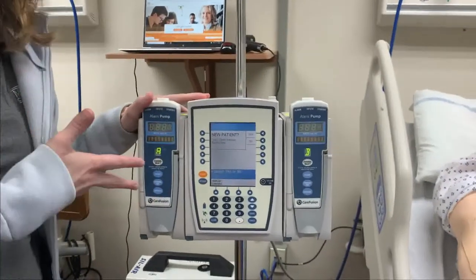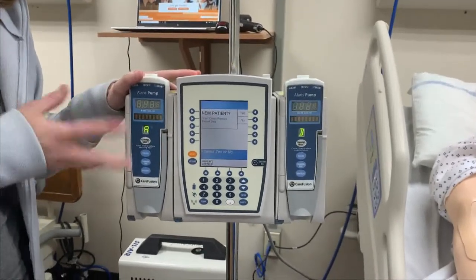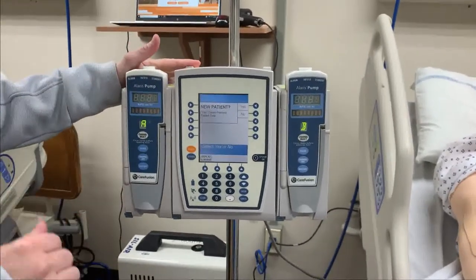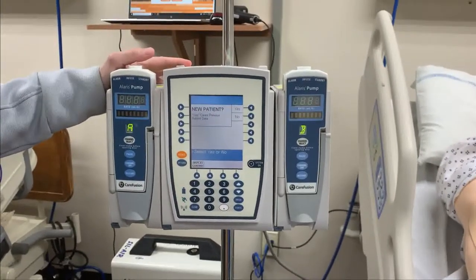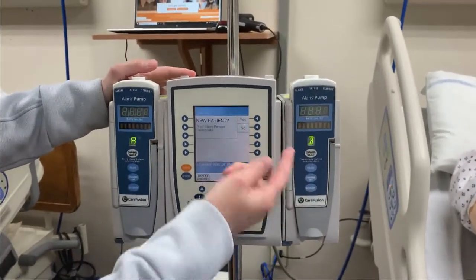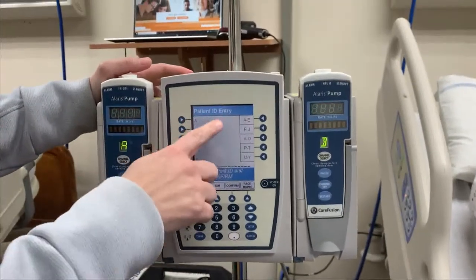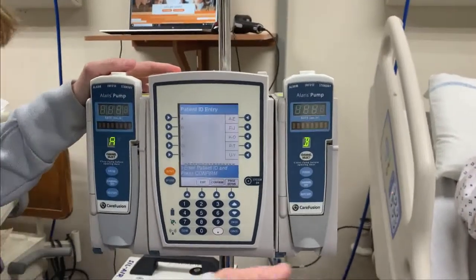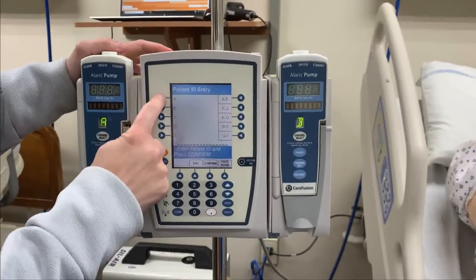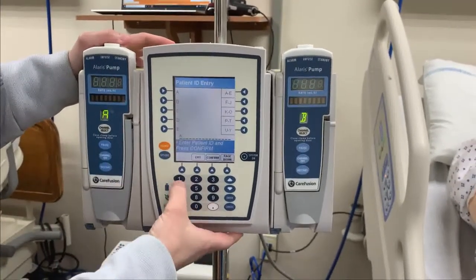Once it comes up, sometimes when you come in your fluids may already be running and you won't have to start at the beginning. But if you do, you turn it on and the first question it asks is: is this a new patient? You can say no, but I'll show you — if you say yes, it's going to ask for the patient's identification. Our patients always have an armband, so you can use that number. But for today, I'm going to say it's patient A.